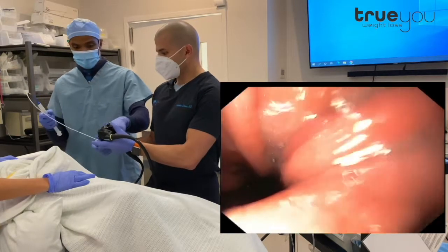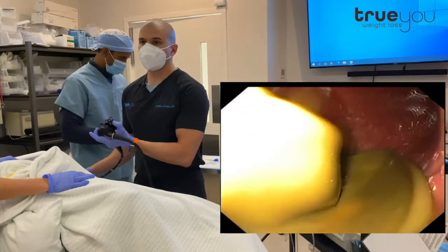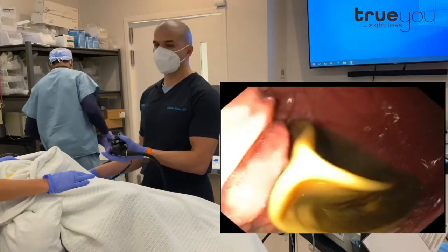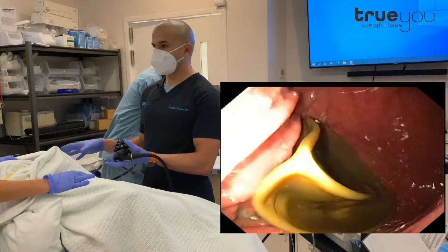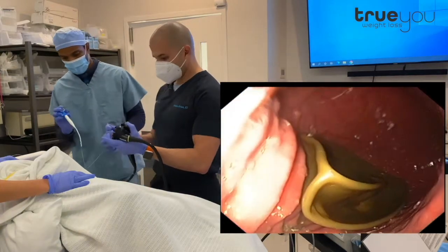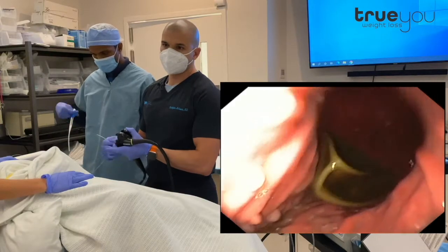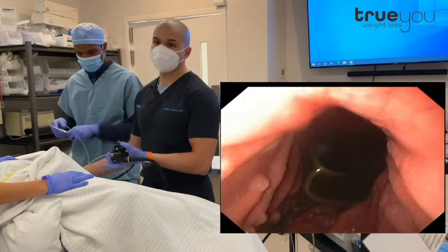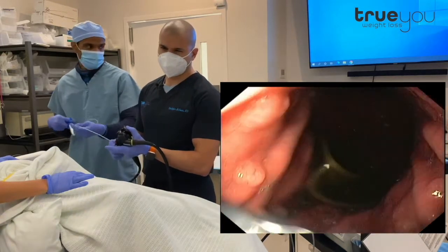Now we're ready to pull it out. We don't perform this under general anesthesia. As long as the patient is on liquids for a couple of days beforehand, their stomach will be empty, and it's perfectly safe to do under just propofol sedation. She's breathing on her own, and that means it'll be a much faster recovery for her. If there's any question — if a patient maybe didn't follow the liquid diet for a couple days — then it's best to be safe and go ahead and use general anesthesia to protect the airway.